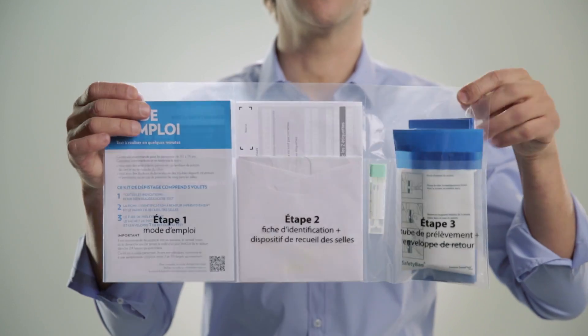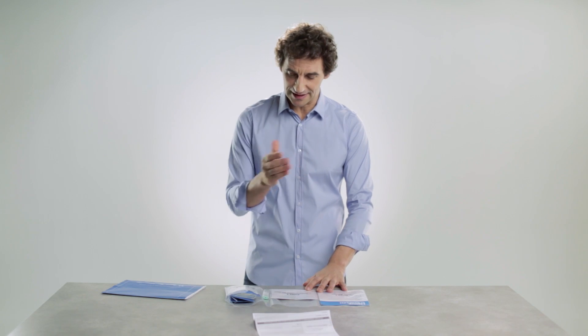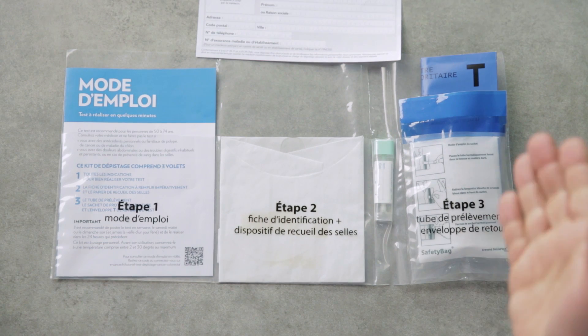The test comes like this, in three parts: instructions, identification form — very important — stool collection kit, sample tube, and return envelope.